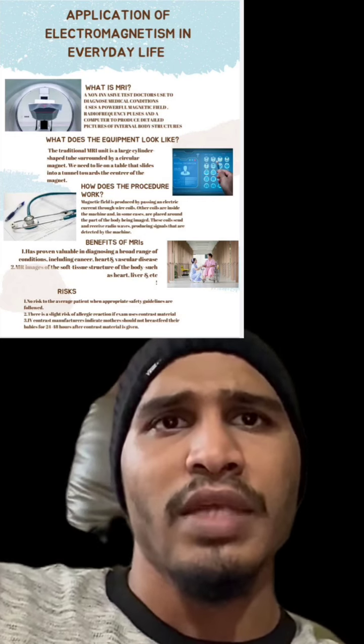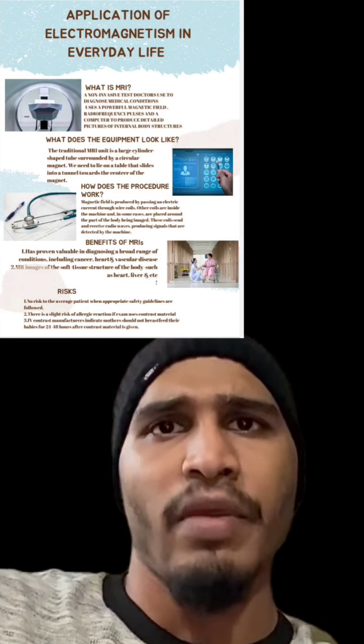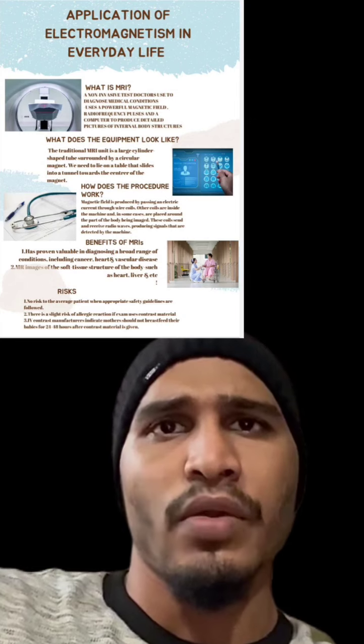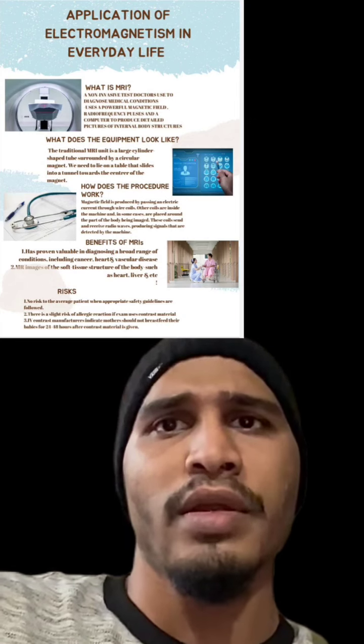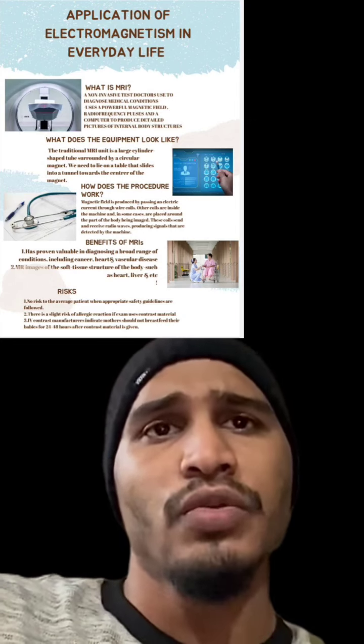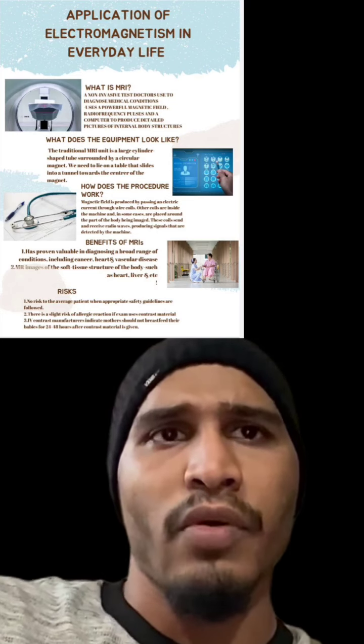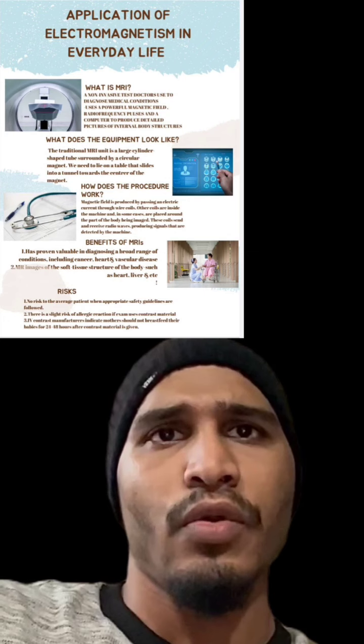One kind of specialized MRI is functional magnetic resonance imaging (fMRI). This is used to observe brain structures and determine which areas of the brain are activated, consuming more oxygen, during various cognitive tasks. It is used to advance the understanding of brain organization and offers a potential new standard for assessing neurological status and neurosurgical risk.